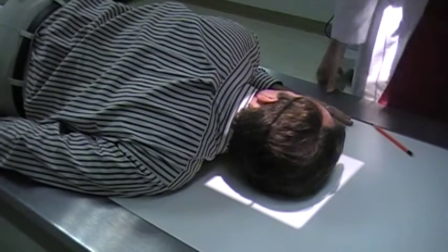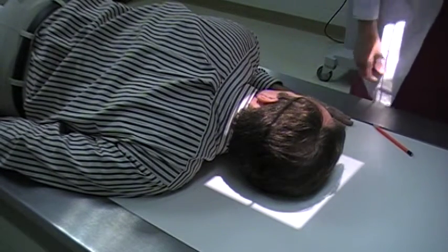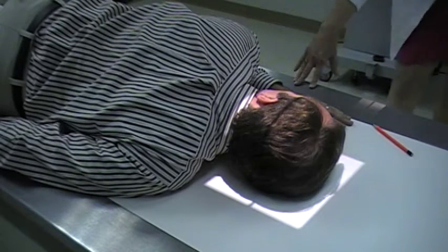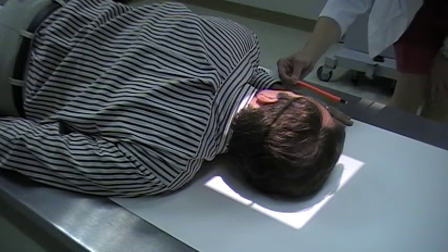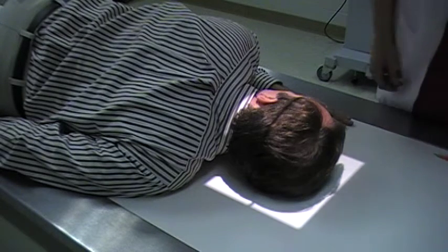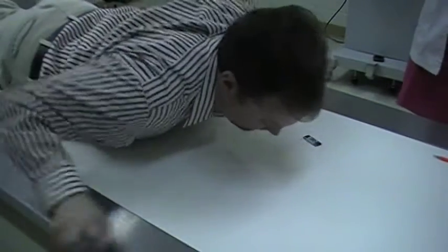Central ray is going to be 2 inches above the EAM. You want to double check, make sure that the interpupillary line is going perpendicular to the table. And then, of course, we want to check our mid-sagittal line, make sure that it is horizontal. Okay, that is our right lateral. Now I'm going to do the left lateral.